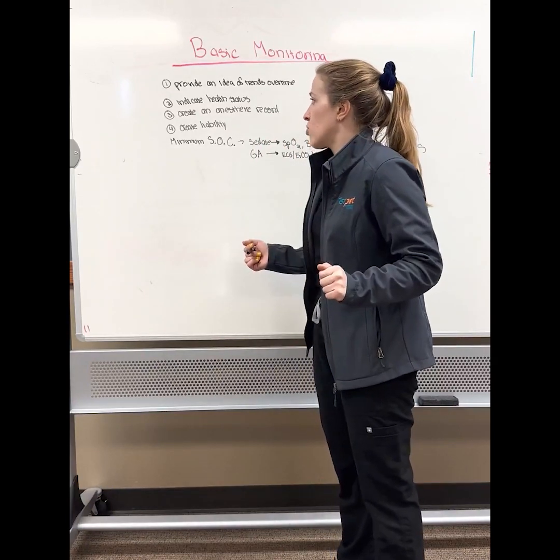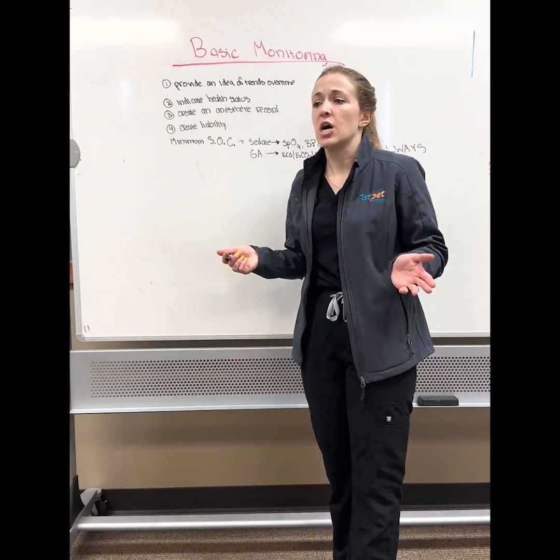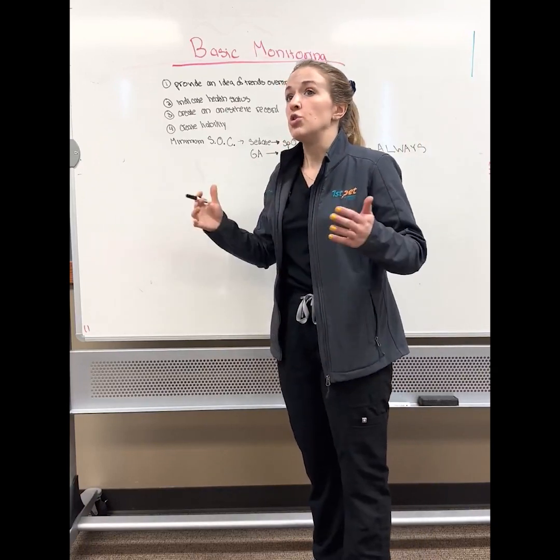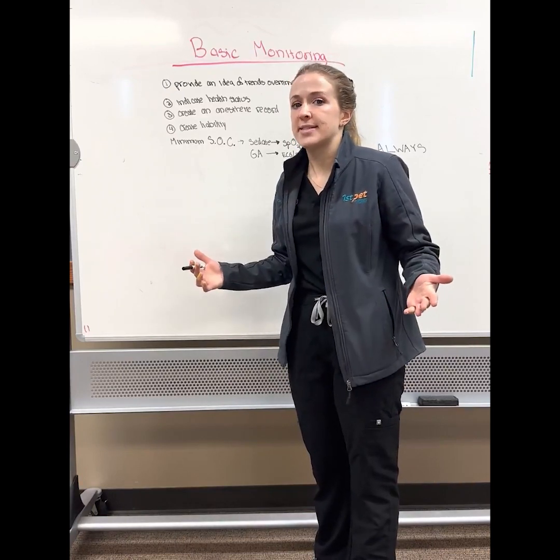Creating an anesthetic or a sedation record. This is something that we should be doing for all patients that are sedated or anesthetized. By monitoring vitals and using basic equipment, you can use those parameters to go into a record, and this basically provides a record of the quality of your anesthetic care.